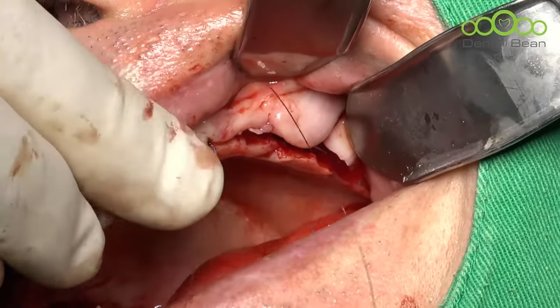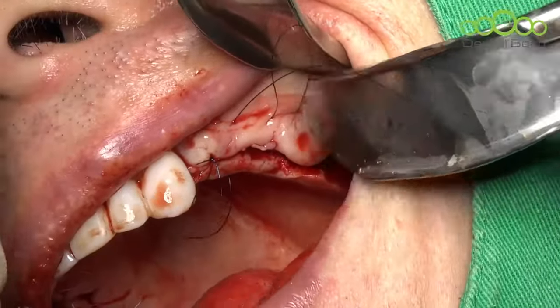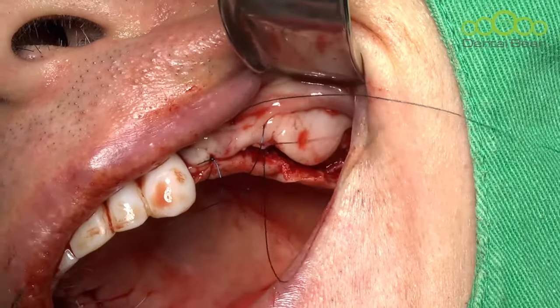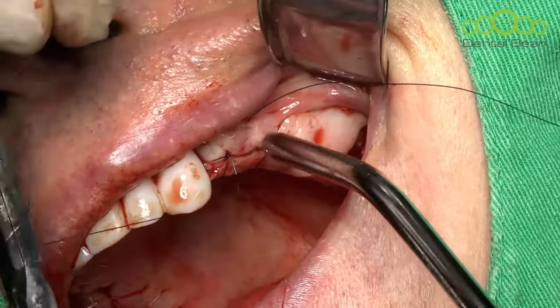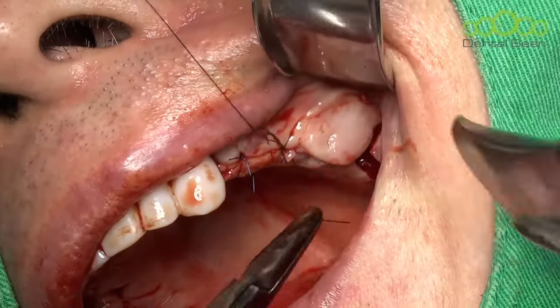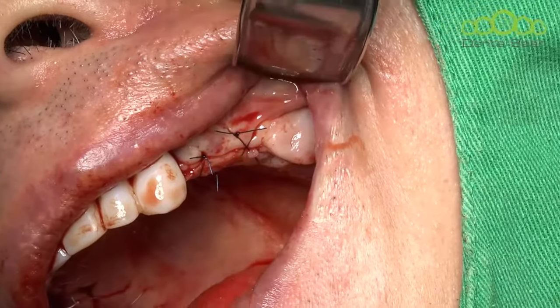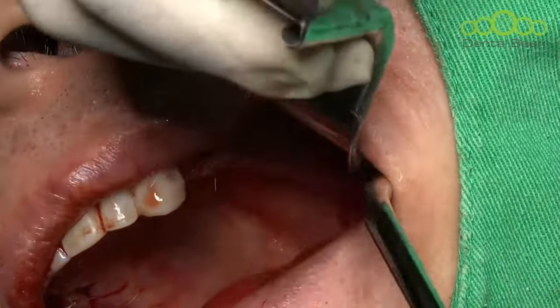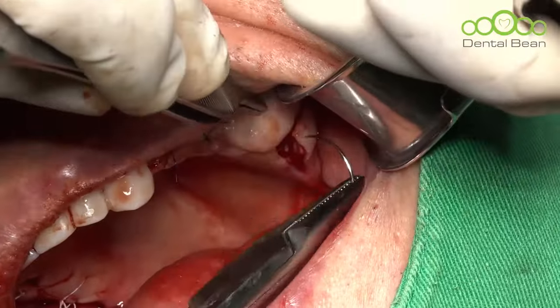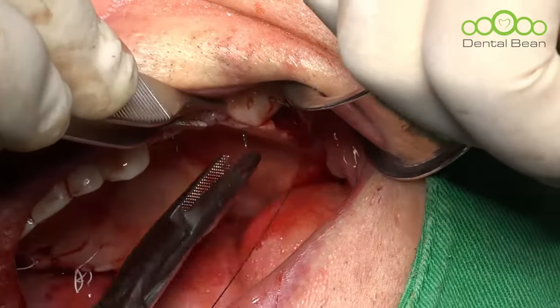And the second one was porcine bone, xenograft. I think many dentists believe that the best xenograft is Bio-Oss. Bio-Oss is available in every country, including China, Japan, everywhere. Also in Korea, everyone says that this is one of the best xenografts. However, the only disadvantage is the cost, it is expensive. So everyone wants to use similar material like Bio-Oss.